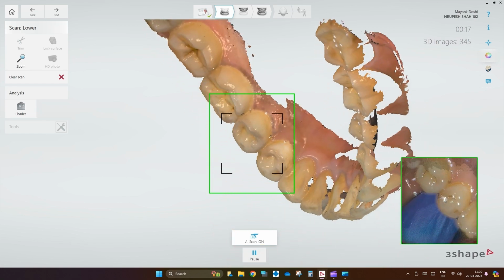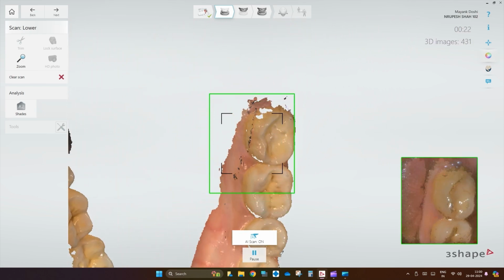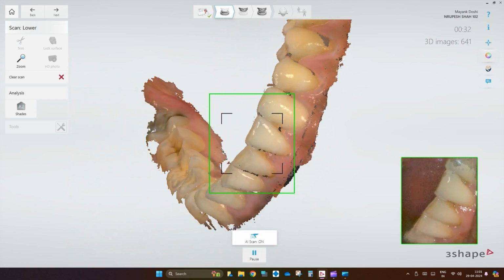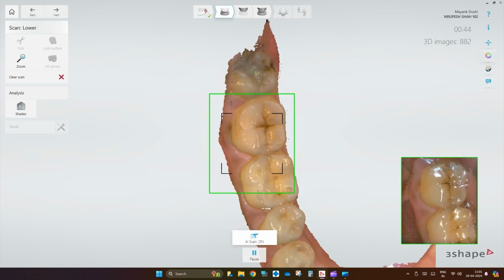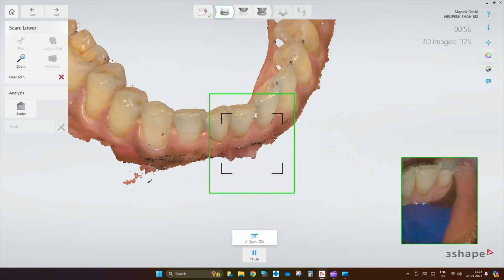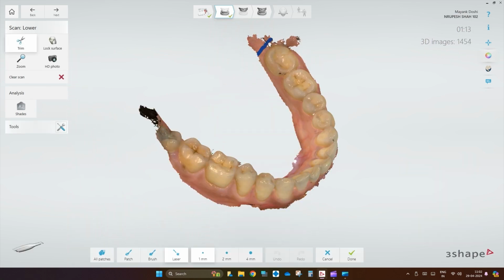One clinical tip here: always have the scanner covering 50% occlusal surface and 50% of the lingual and complete the arch to have maximum accuracy, and then rolling over and completing the buccal the exact same way. It's always advisable to trim the unnecessary data so that it doesn't interfere with the future alignment of scans.